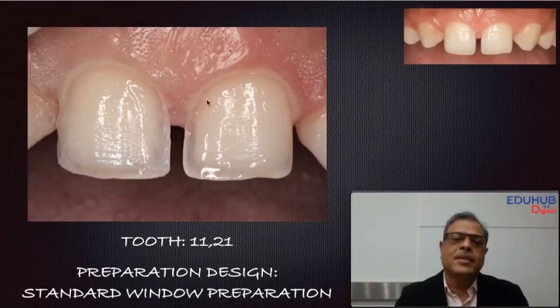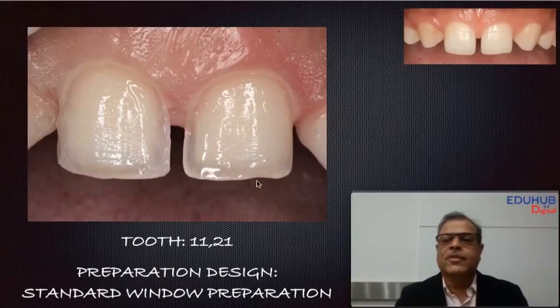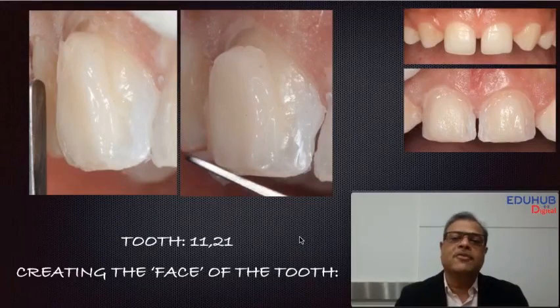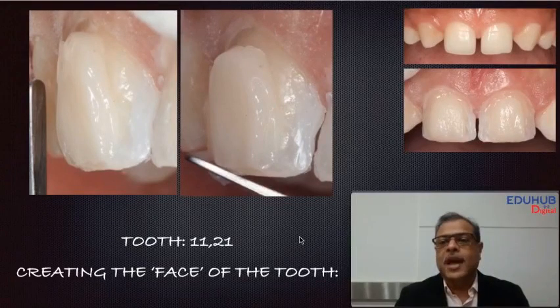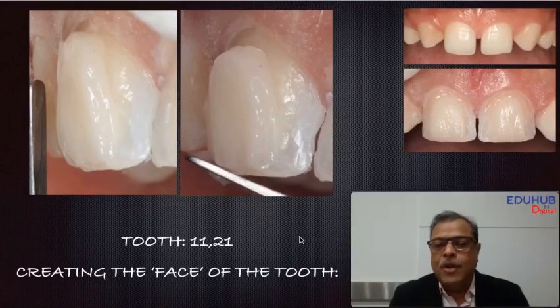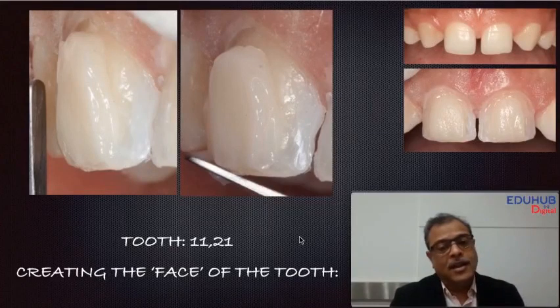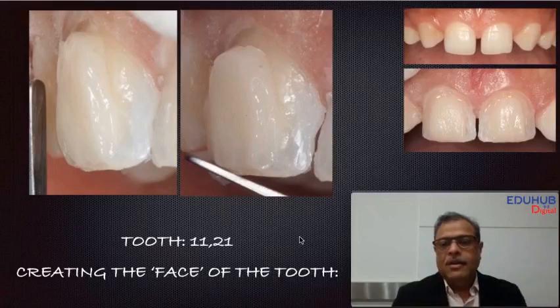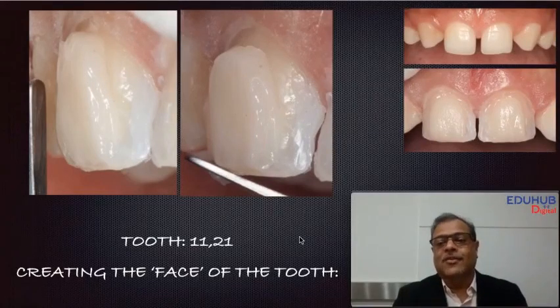We start by putting a little bit of flowable material in the very sharp edges, then we place the first layer of composite. With the first layer, we want to create the face of the tooth and match the face on either side, while keeping it narrow enough so the tooth doesn't look wide. We also ensure the teeth are not flattened but rounded off a little bit so the tooth doesn't look too big.